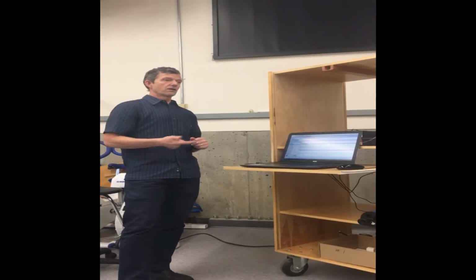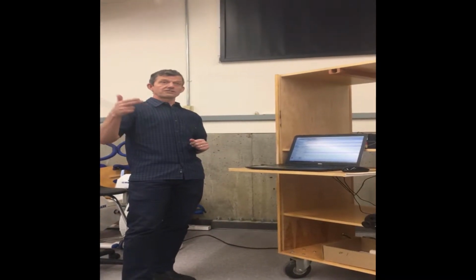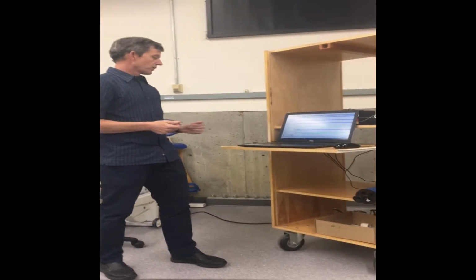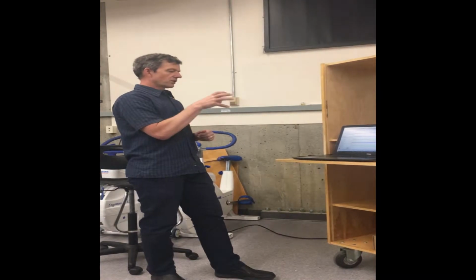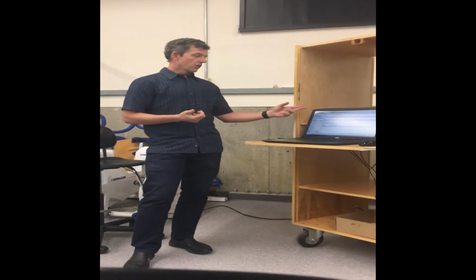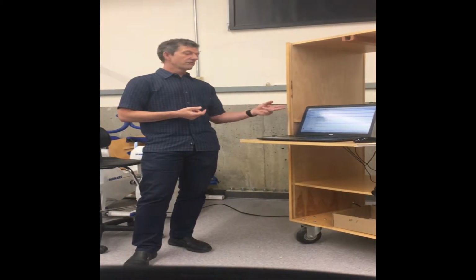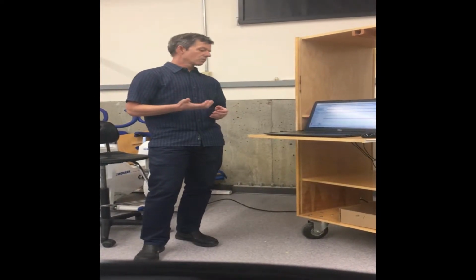As we're going along, you'll see that the subject's VO2 after 5 minutes is 23 mils per kg, and as they go along you'll see that number get higher and higher, so we can see that in real time. It'll also tell us what our RER value is as well. So the nice thing about this is in real time you're looking at heart rate, you're looking at CO2, you're looking at O2 concentration. When I'm doing this test, to start with, I want to make sure that all of the values make sense. As soon as we start the test, I want to make sure that that's a reasonable CO2 value, that's a reasonable oxygen value, that's a reasonable flow rate, and then I want to make sure that the heart rate monitor is working as well.